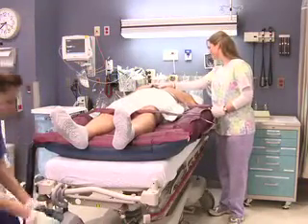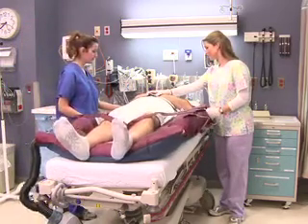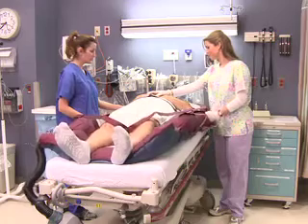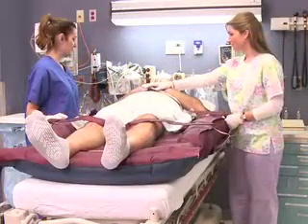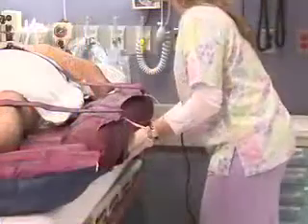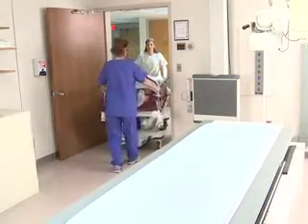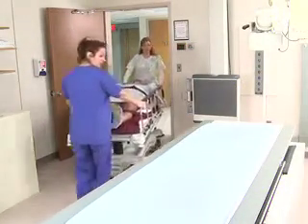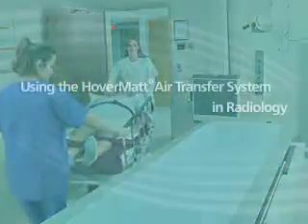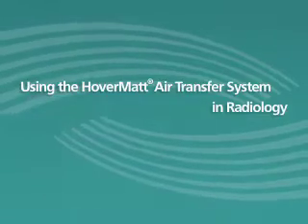The HoverMatt must be deflated for the X-ray procedure and patient safety straps unbuckled and moved away from the X-ray site. Once you have taken the X-ray, assume the position of safety. Reinflate the HoverMatt and remove the cassette. Turn off the airflow of the air supply by pressing the standby button. The emergency patient can also be transported directly to imaging on the HoverMatt. Please view Using the HoverMatt Air Transfer System in Radiology for more information.